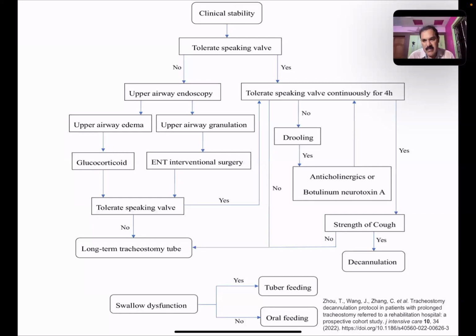Normally in room air, the oxygen concentration is 21%. In the hospital, the lines through which the oxygen comes carry 100% oxygen. Normally when you give oxygen through a cannula, it comes through a water bubble bottle. Here it is not like that; that bottle is not there when the patient is attached to the ventilator. The ventilator is attached directly to the oxygen line, where 100% oxygen is coming. The ventilator has the ability to mix that 100% oxygen with room air and reduce the concentration. This is the FiO2. You can set the FiO2 at 80%, 60%, 40%.